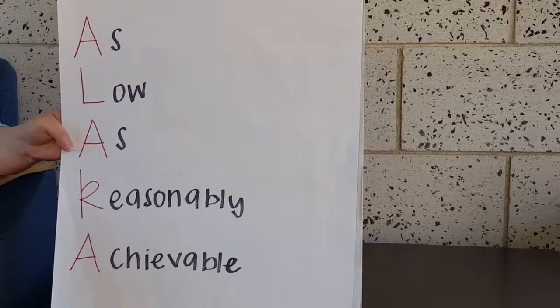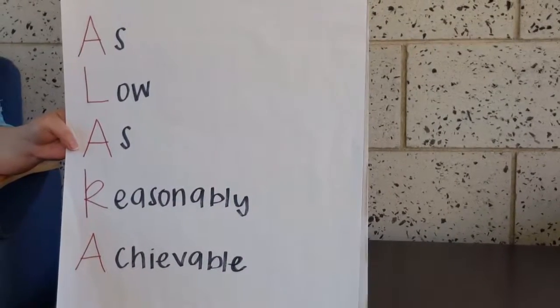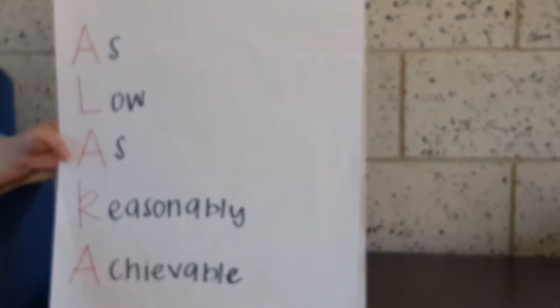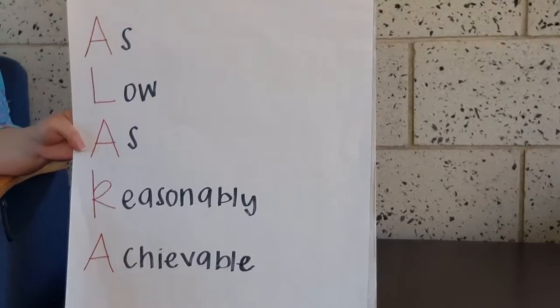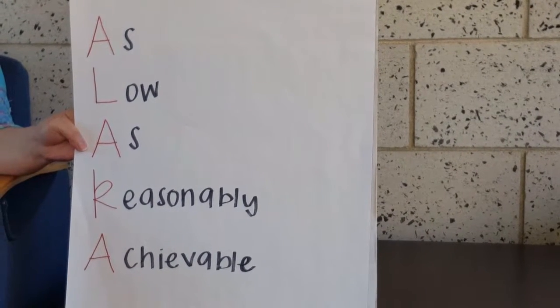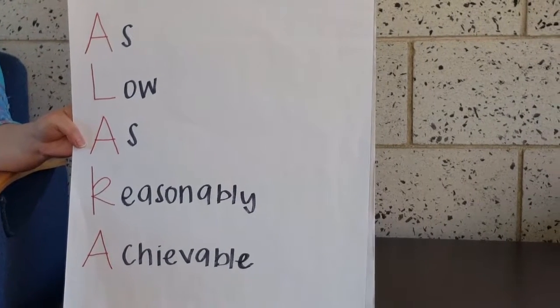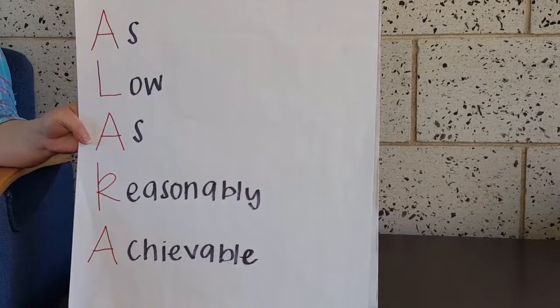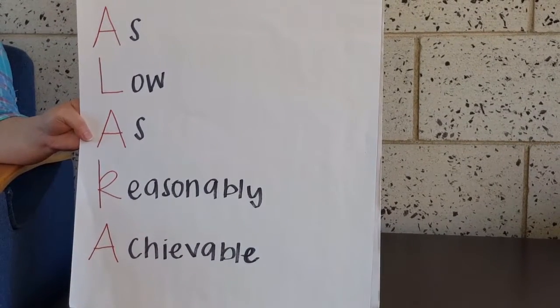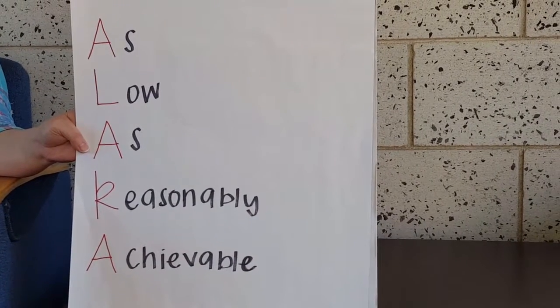The ALARA principle was introduced in 1990 and is defined as as low as reasonably achievable. Its predecessor, ALAP, which is known as as low as practicable, was used until 1990. The principle states only use ultrasound when medically necessary, keep scan times as low as possible, use minimum power settings to produce a diagnostic image, and increase transmit power if clinically necessary so you don't miss diagnostic information due to underpenetration.